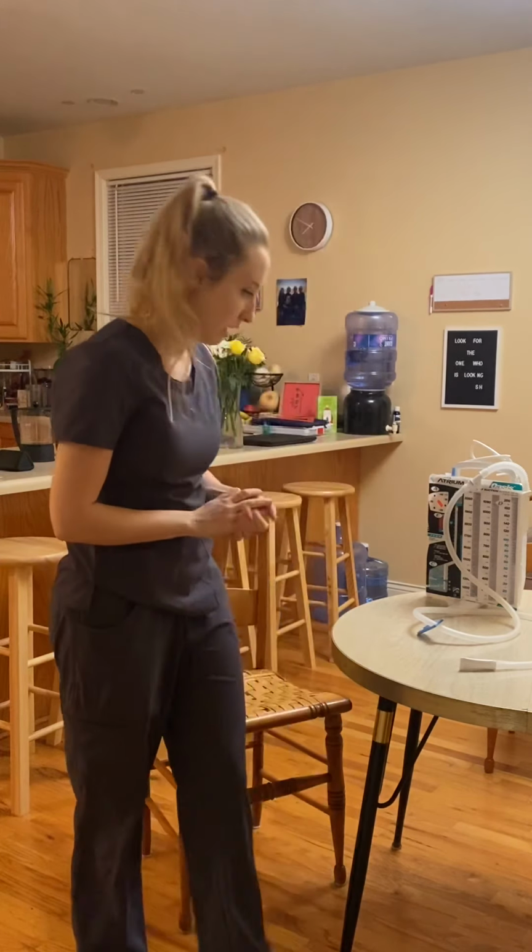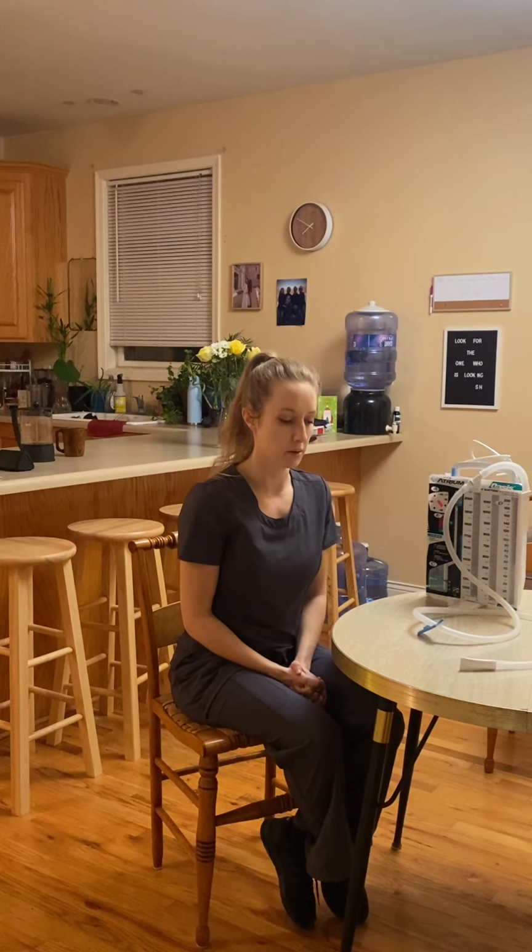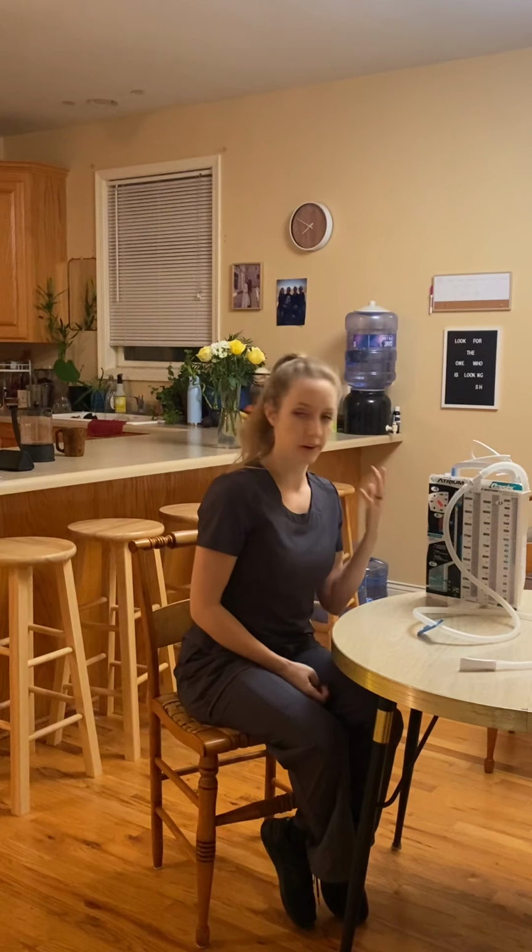I am an 8th semester nursing student, and today I will be demonstrating how to explain chest tube care and maintenance to a patient. I'm going to say my patient today is Mr. Smith, and he just came out of surgery, and I am explaining to him what we're assessing, what we're looking for in terms of assessing his drainage and his progress with his chest tube.